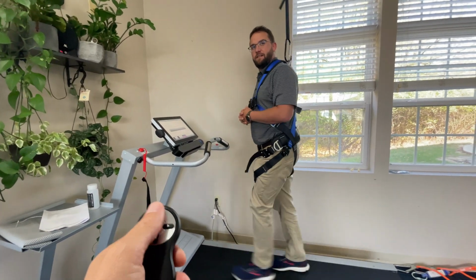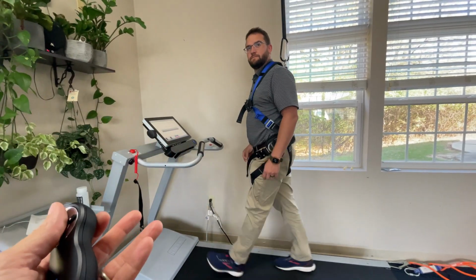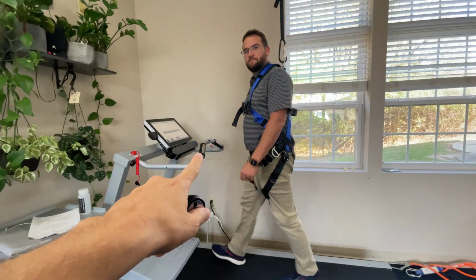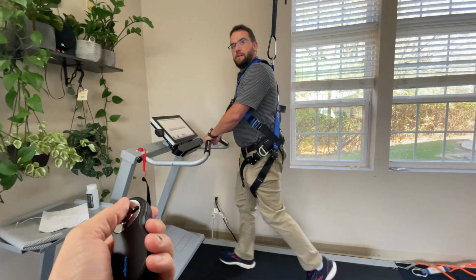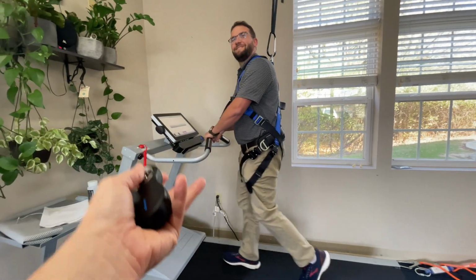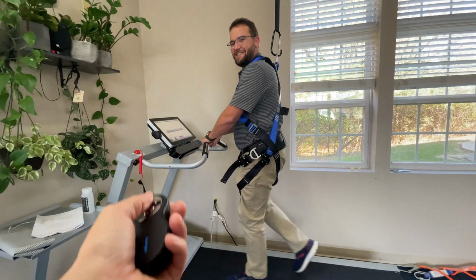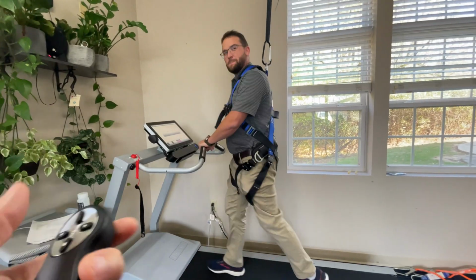So first I want to acclimate them a little bit to what it's going to feel like, what it's going to do. I will typically have them hold on to the handrail first. I will tell them I'm going to push the trip button. I'm going to count down from 3, 2, 1, and then I'll push it. So I'm going to push the trip button, 3, 2, 1. And so that gives them the chance to feel it.